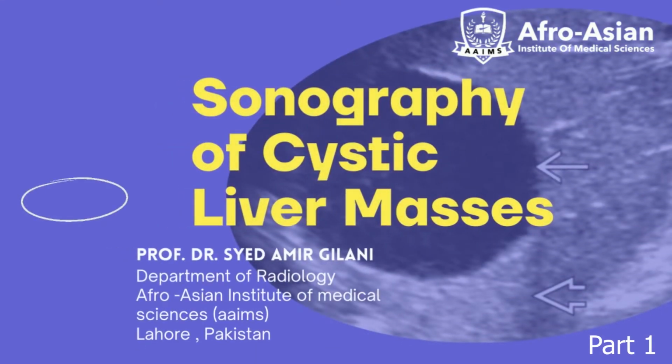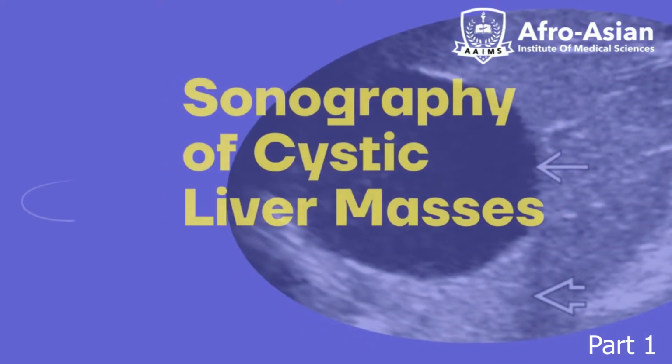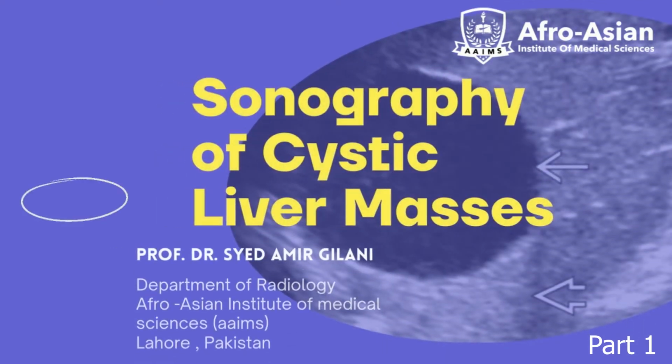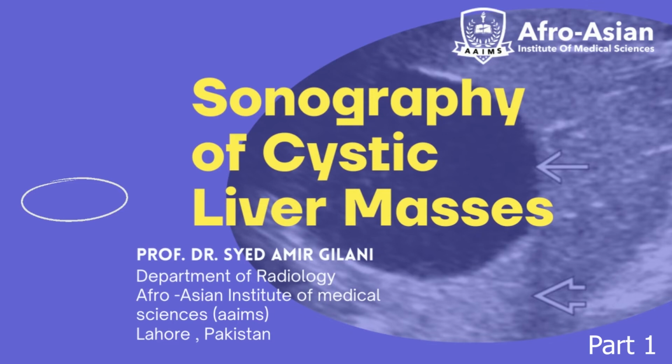Bismillahirrahmanirrahim. Topic is the sonography of cystic liver diseases. As we discussed, there are three groups of abnormalities which are commonly seen. One is the diffuse liver diseases. The second one is focal liver diseases, and focal liver diseases is further divided into cystic liver diseases and solid liver diseases. So let's discuss the sonography of cystic liver masses.